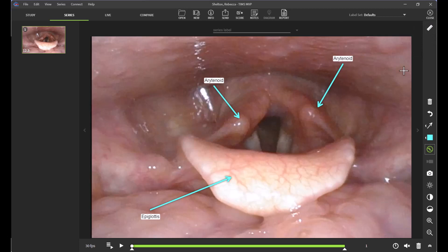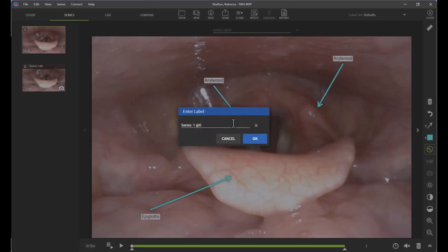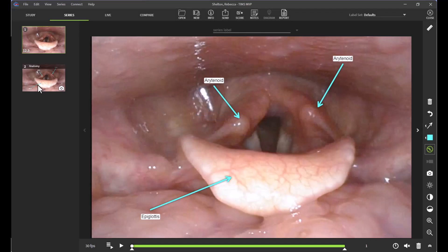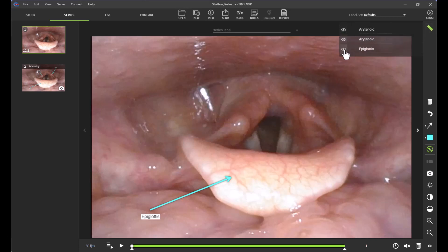To create a snapshot to archive with the entirety of the study, I'm going to click the camera icon as shown and TIMSS is going to prompt me to label this snapshot. By clicking OK, you can now see that I have a snapshot here on the left-hand side of my screen labeled 'anatomy.' Now I'm able to go back through and review my full study frame by frame without the telestrations by clicking my eye icon, and I still have my snapshot saved.